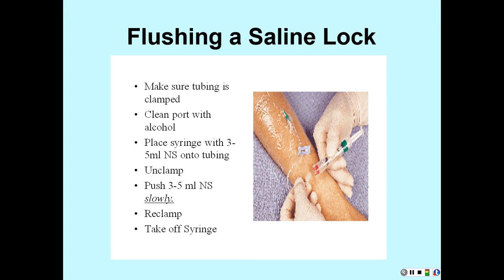Most places irrigate saline locks every 8 hours or once a shift. And we always want to flush before and after any medications that we give.